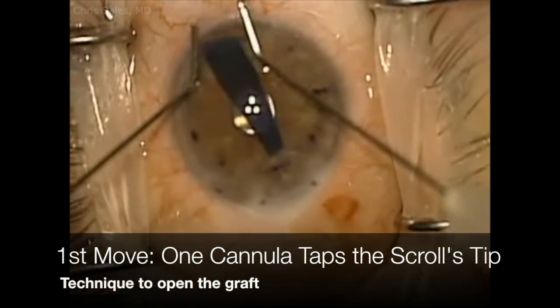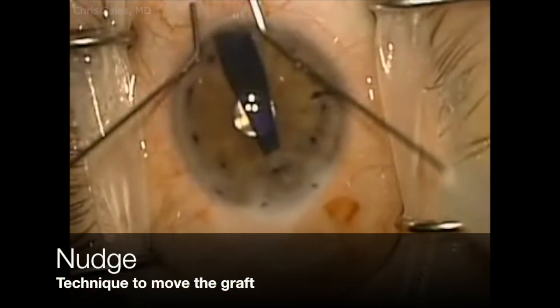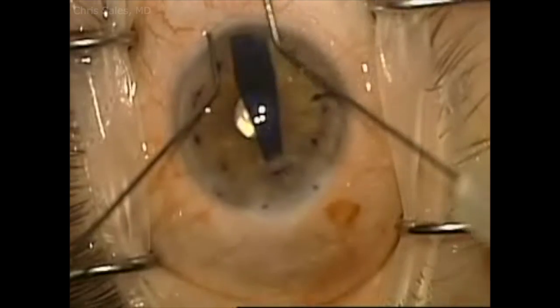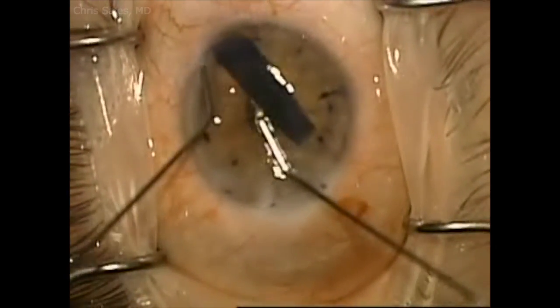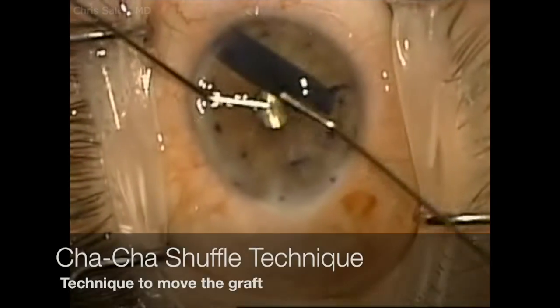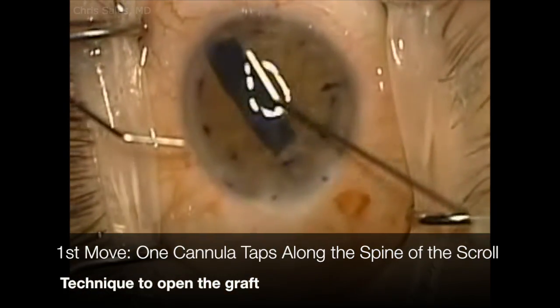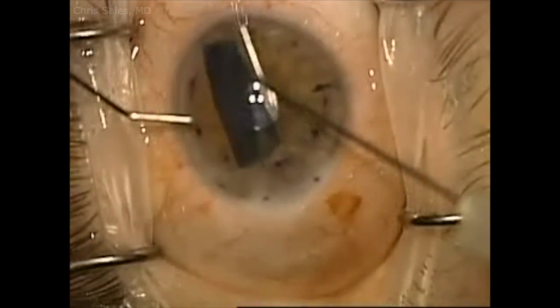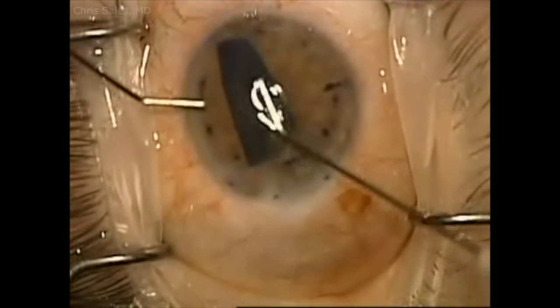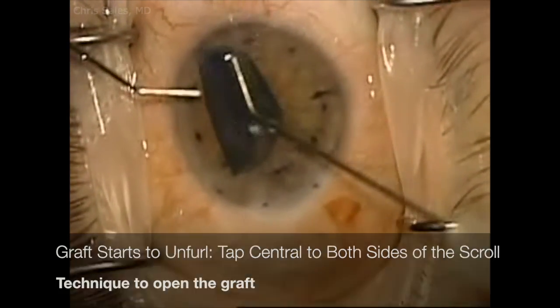I take another attempt here by tapping on one end of the scroll and nudging the scroll back into position when I need to. It's starting to respond but not quite, so I now try and push the entire scroll into a more shallow part of the chamber with a cha-cha shuffling technique. At this point the scroll starts to respond to the tapping and I continue to gently tap down the spine of the scroll, central to each side of the unfurling leaflets.